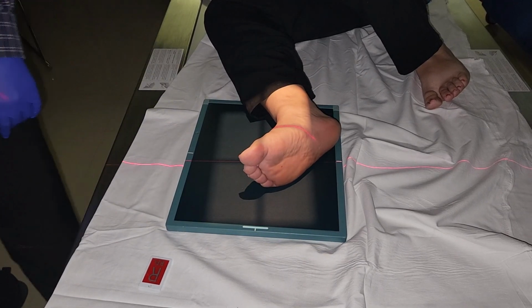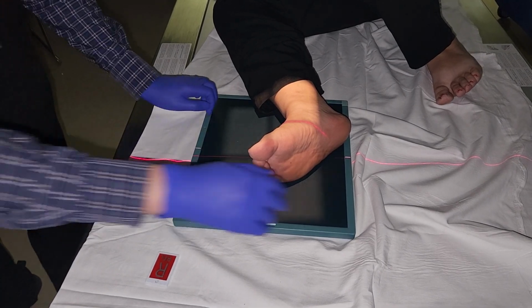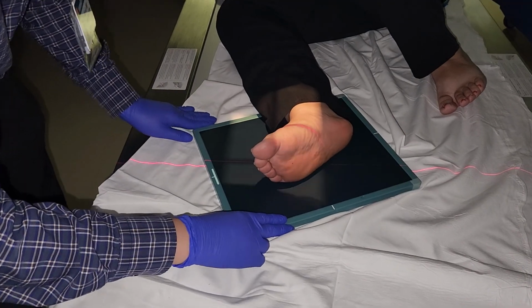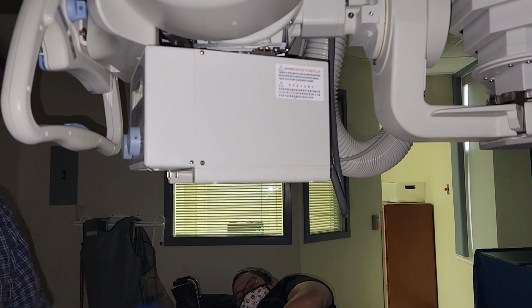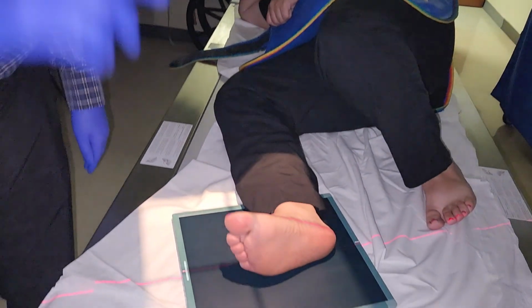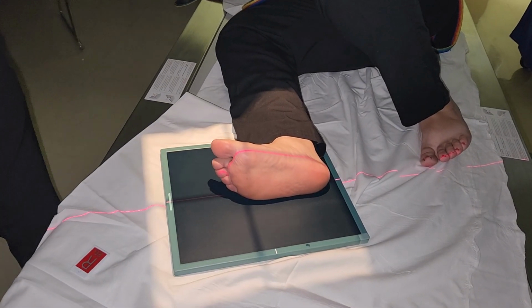All right, so slide this up. This time, once again, long axis of the foot, we'll turn our cassette to match the long axis. All right, so lift up. Great. Now, something else that we need to make sure to do here is to dorsiflex the foot. What do we mean by dorsiflex? Bring the foot and toes up. Good, very good.